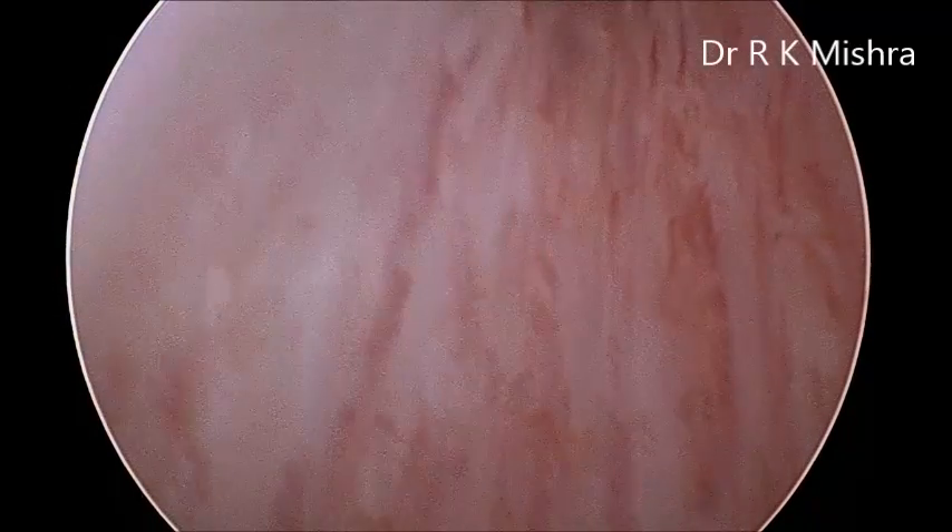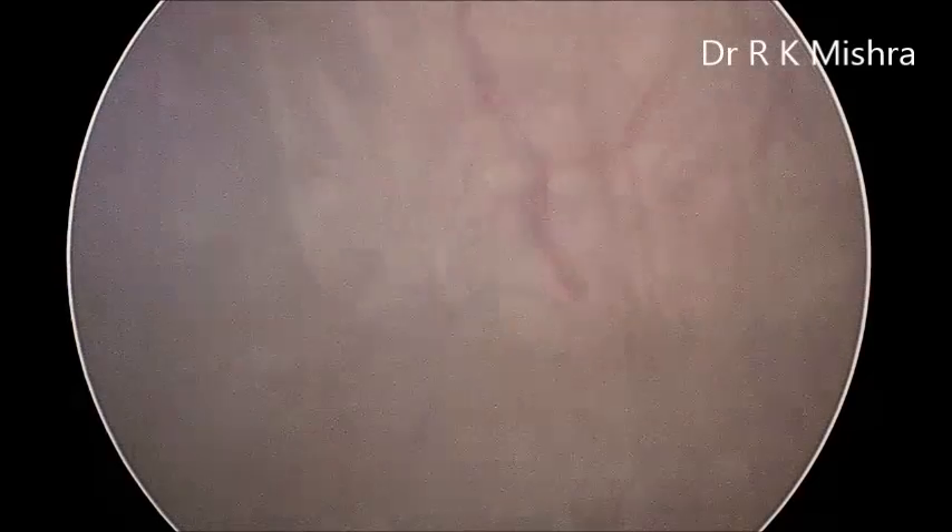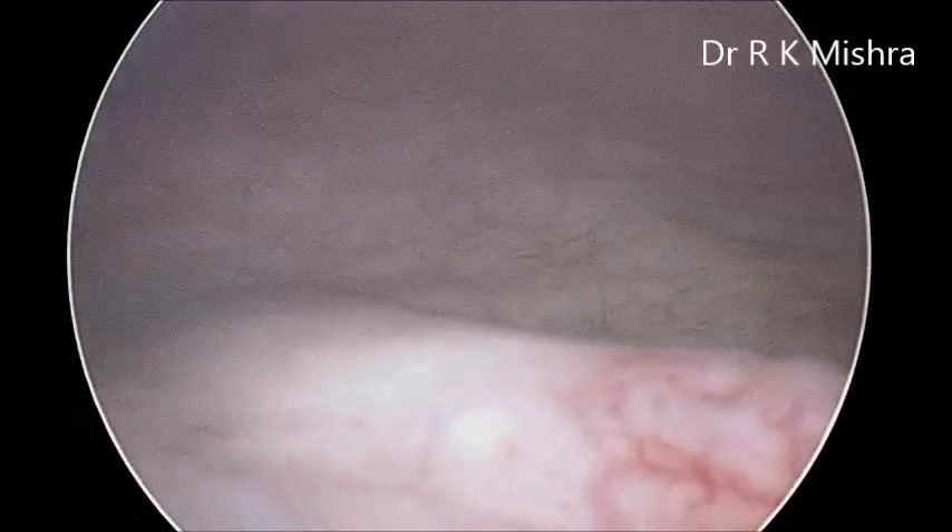Then you can enter into the bladder. This is the bladder. You will go to the posterior wall of the bladder, and just at the place of the trigone you can see the ridge of the ureteral orifice. Here is the ureteral opening in the bladder.